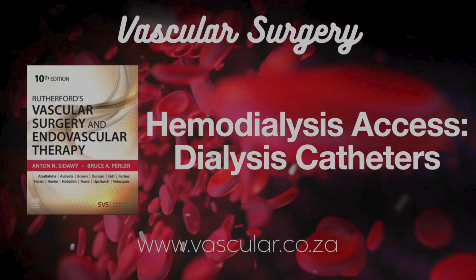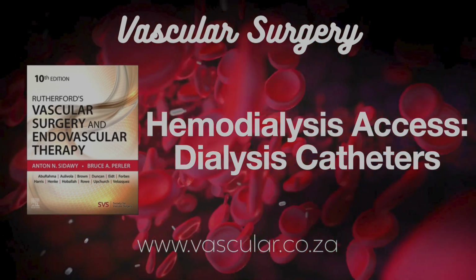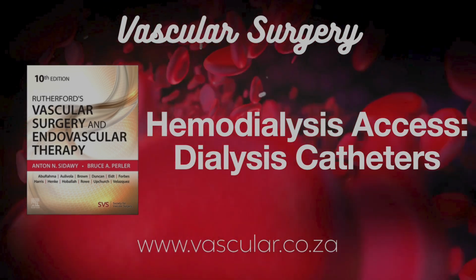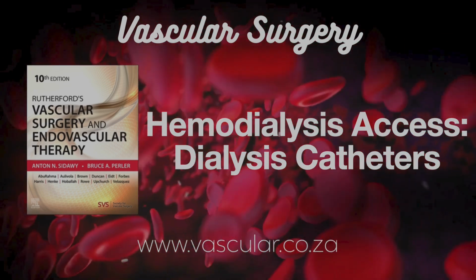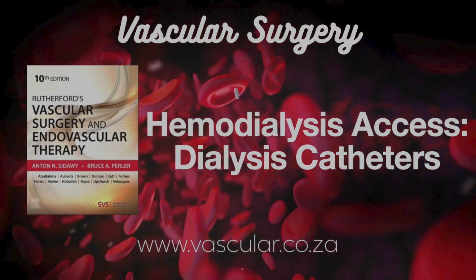It's a huge percentage, and it's important to distinguish them from the acute catheters you might see more in, say, an ICU setting. Right, those are different. Yeah, the acute ones are more temporary. They don't have that subcutaneous cuff, which means a higher risk of infection, and they can slip out more easily, really for short-term use. Okay, so we're focusing on the TDCs today, the longer-term option.